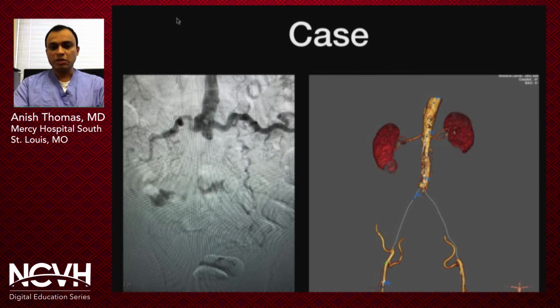Crossing these sometimes can be challenging. However, in this case, for the most part, you will need a 3-point access. In this case, we got radial access and bilateral common femoral artery access using ultrasound. You've got to be careful. One way you can get your sheath is to access the distal common femoral artery and actually wire the lateral circumflex branch with a micropuncture kit.